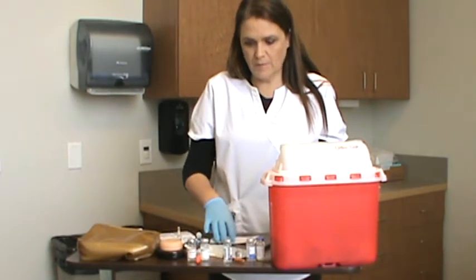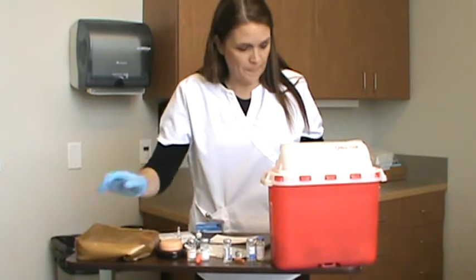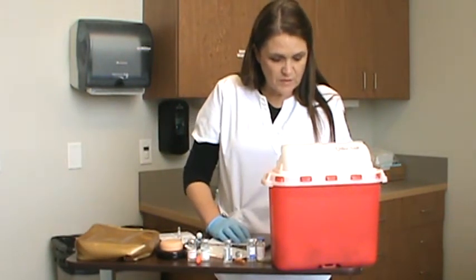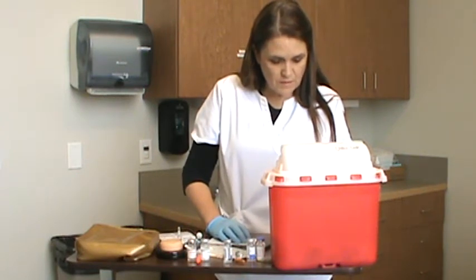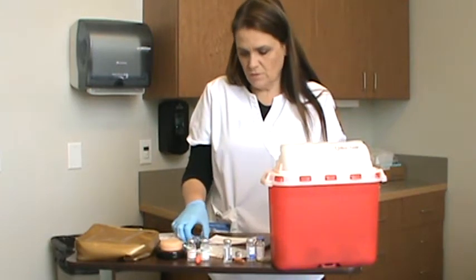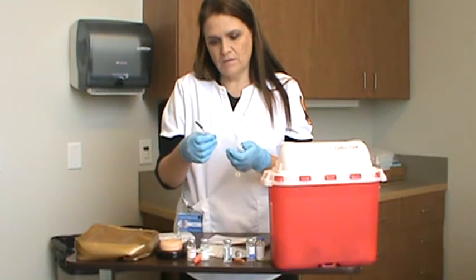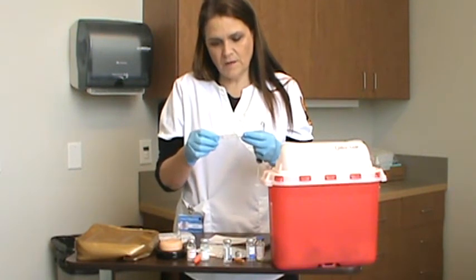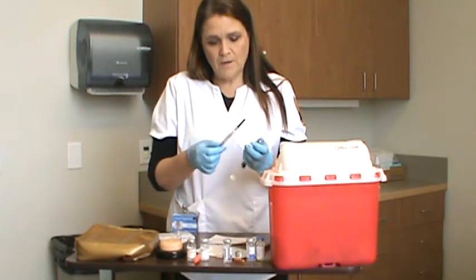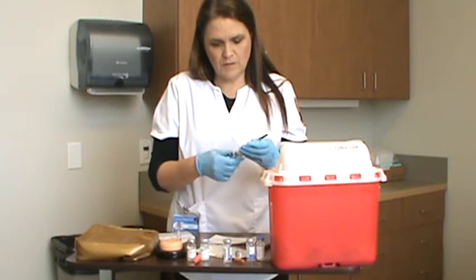So now I'm here and I'm going to check my MAR again and check my medications as I pull them. The first IM is morphine sulfate, 15 milligrams IM stat. We have the Carpuject, and I would check that this is morphine sulfate. This is actually 20 milligrams per 2 milliliters, and so I would just show how to do this one.